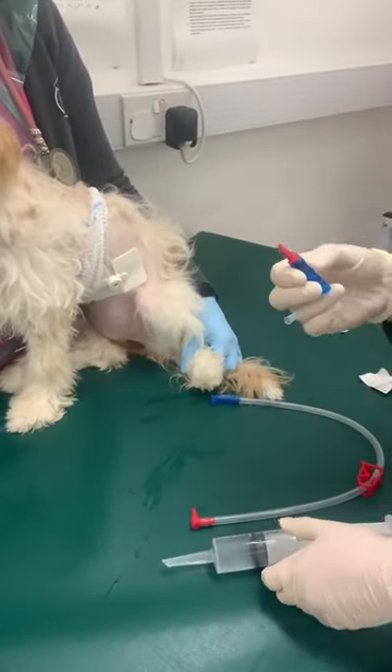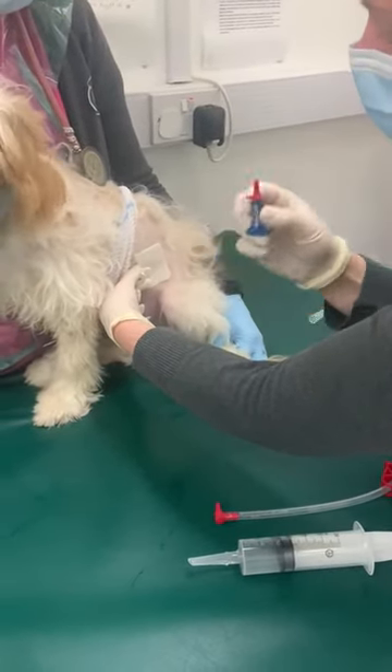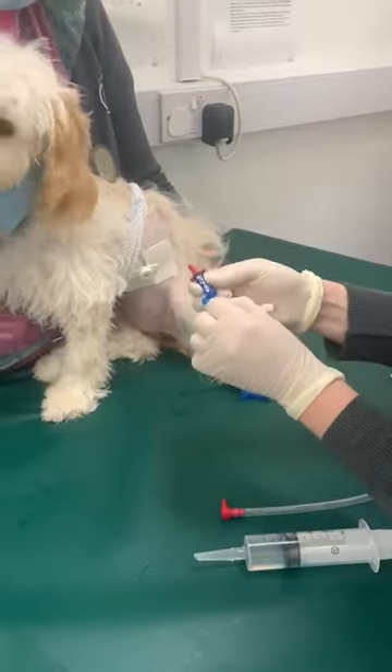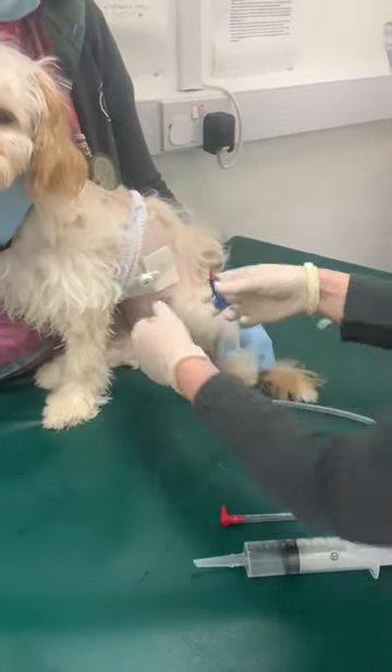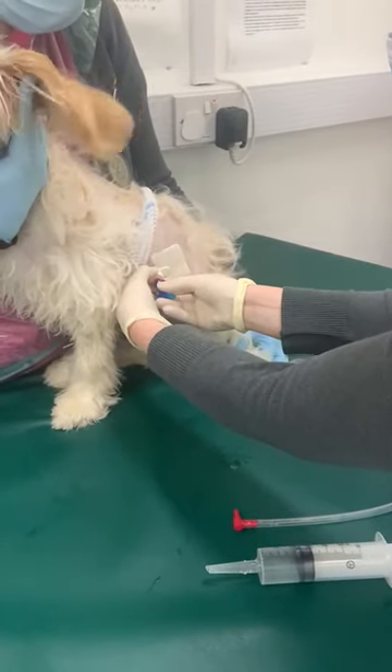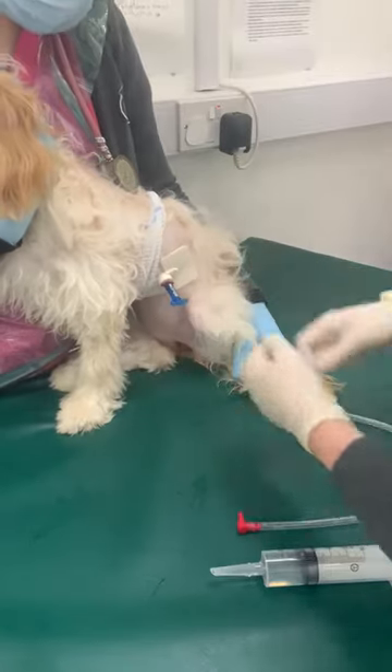We're going to start with this attachment. Hold the tube — it's the red attachment. Just make sure that this is shut off, otherwise you'll get some liquid come out of it. Push it into the centre and you'll hear a little click, and it needs to go all the way down.